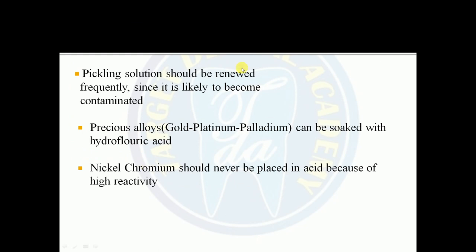Pickling solution should be renewed frequently since it is likely to become contaminated. So you have to renew it frequently. Precious alloys, that is gold, platinum, palladium, can be soaked in HF, hydrofluoric acid. Nickel chromium should never be placed in the acid because of its high reactivity.